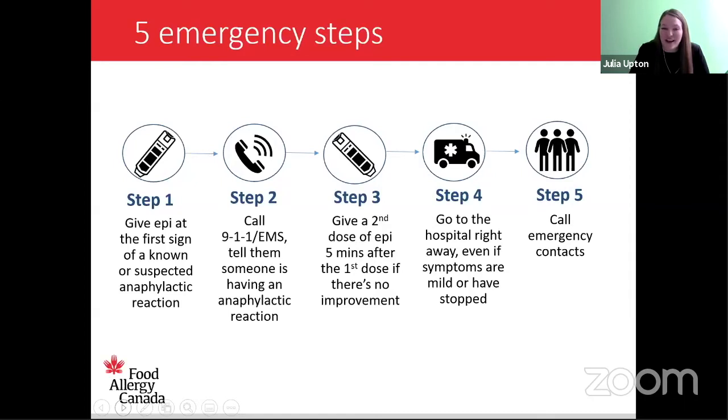We recognize that people are using this in an emergency, and so sometimes it's not easy to remember every step. But yes, it likely increases the absorption of the medication. And so if it can be done, then that's great to do. But I don't think I'd beat myself up about it if in a panic I forgot.